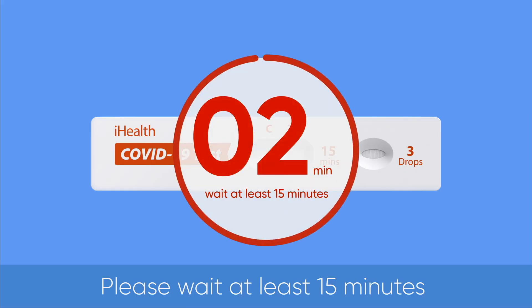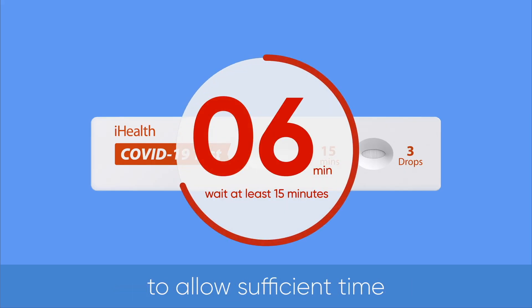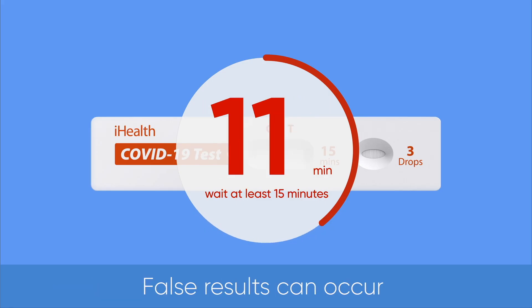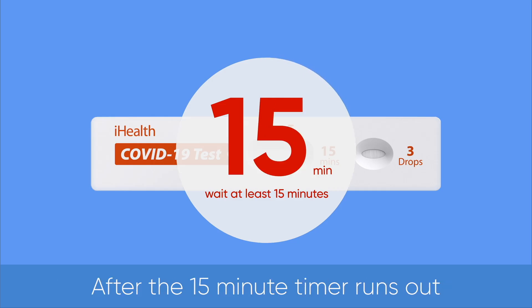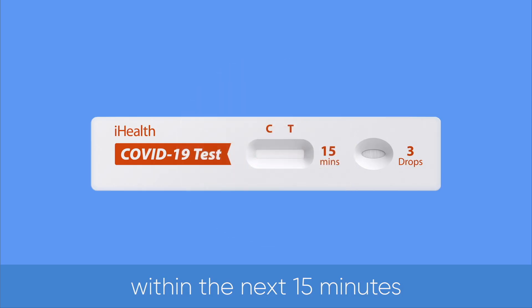Please wait at least 15 minutes before interpreting the results to allow sufficient time for the test card to process your sample. False results can occur if test results are read before 15 minutes. After the 15-minute timer runs out, please read your result within the next 15 minutes.